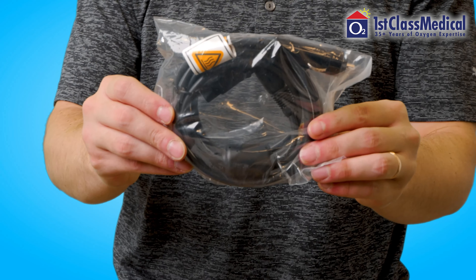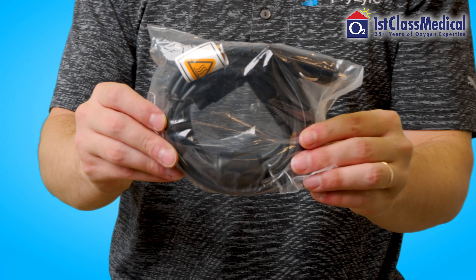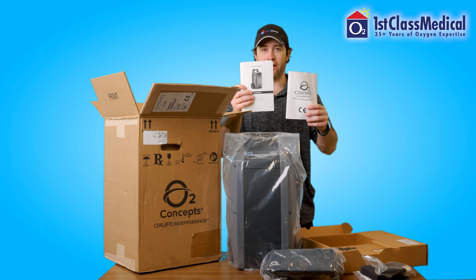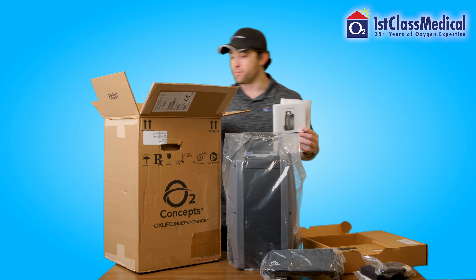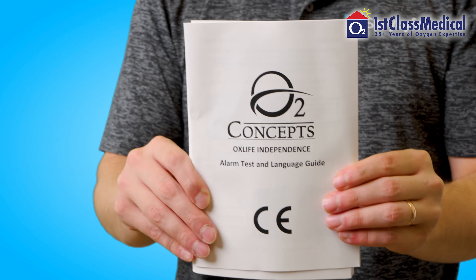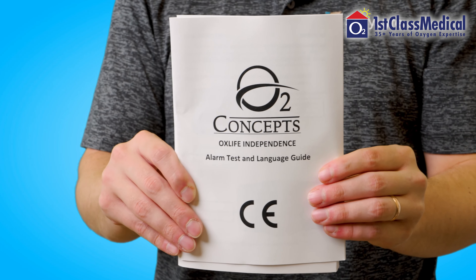DC power supply — this is for the cigarette lighter in your car. Of course, you always have a manual. We will have the manual as well that will come with the Independence.